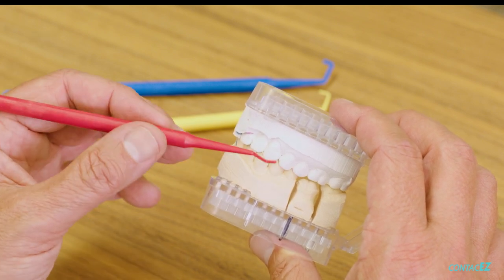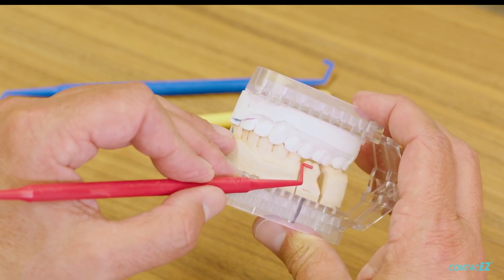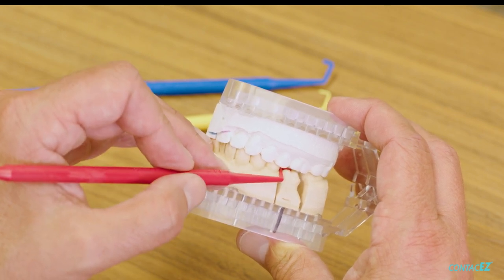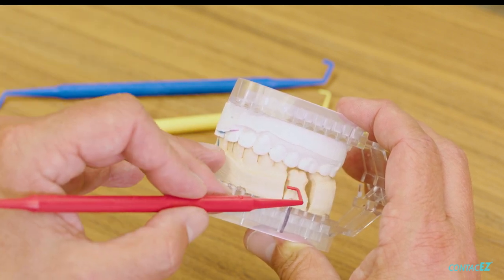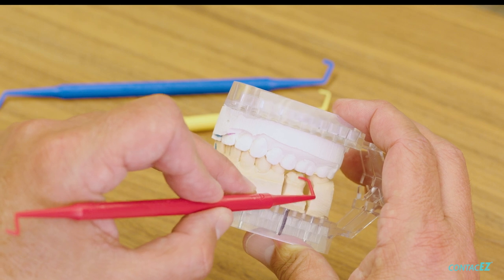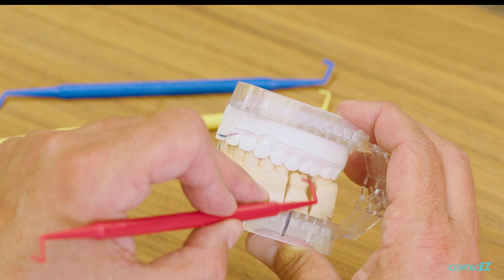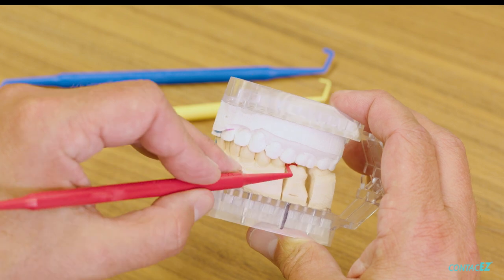Let's try the 1.5 millimeter PrepSure guide and see if we happen to have 1.5 millimeters here. I'll take the mesial portion, set it on the mesial buccal cusp tip, slide up and over — it goes right into the central groove. But as I try to go farther to the lingual, I'm bumping into that lingual cusp. So we have less than 1.5 millimeters of reduction on the lingual cusp and a little more than 1.5 on the buccal cusp. Then I'll flip it around to the distal end, set the tip on the distal buccal cusp tip, and as I go to slide over into the central groove, I'm banging into the opposing tooth and can't get in there. So on this distal buccal cusp we might have 1.3 or 1.4 — usually you'll be able to click through there, but I'm probably at 1.2 or 1.3 here, even though I did have 1.5 when I measured it on the mesial cusp.